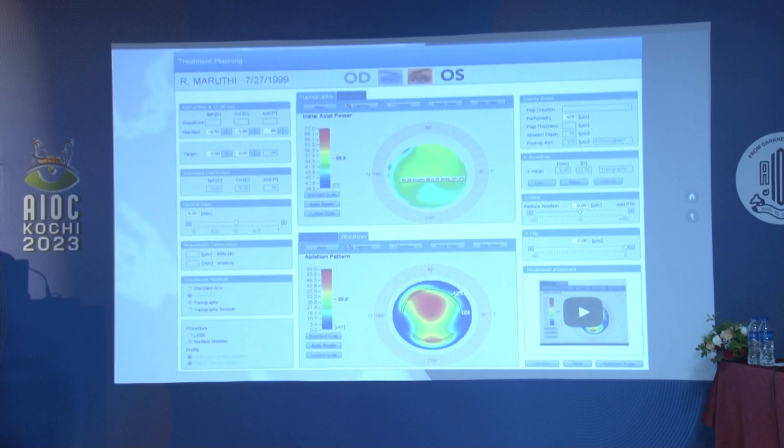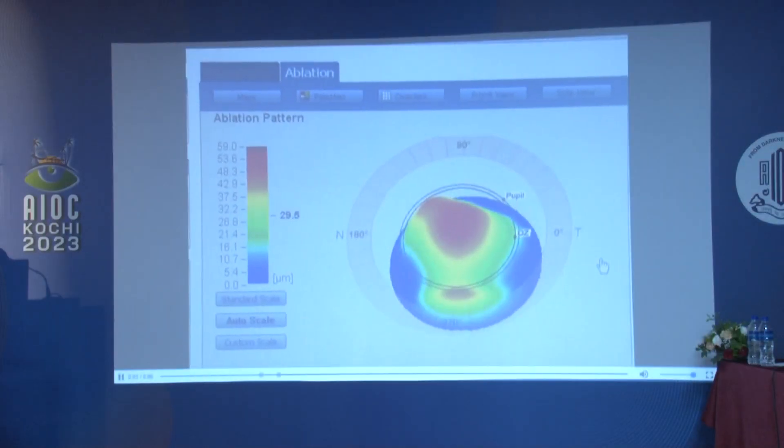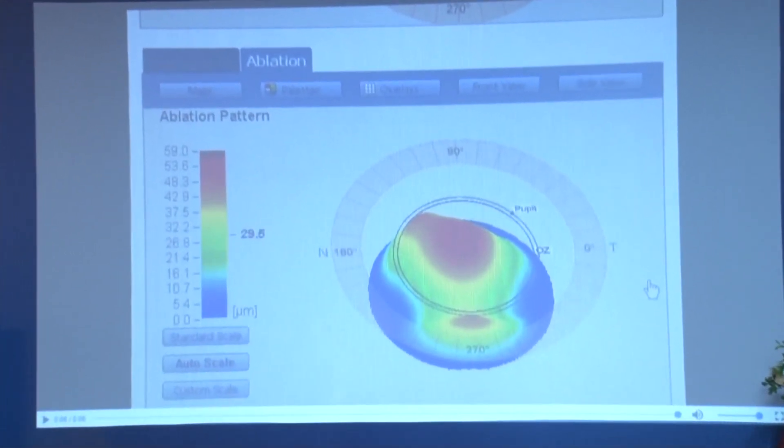This is all linked to one another. In CRS master, the main workstation, we enter pachymetry values, manifest refraction, and optical zone. Here we can interplay between 5.5 to 6.5 mm depending on corneal thickness, and we choose a topography treatment. When we do that, it shows the ablation pattern exactly focusing on the cone. This can be further confirmed by a 3D representation that CRS master provides. You can see there is so much irregularity on the cornea which can be tackled precisely.